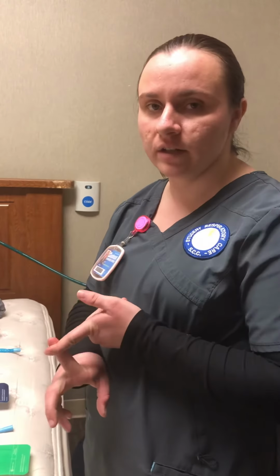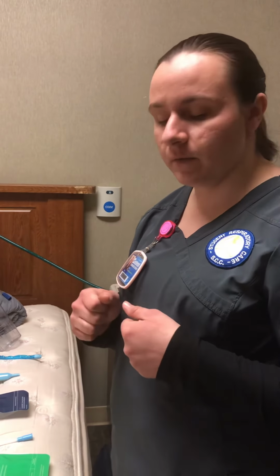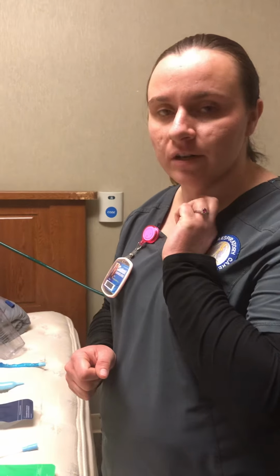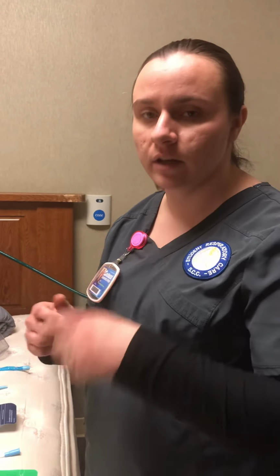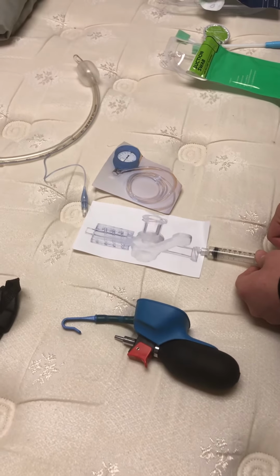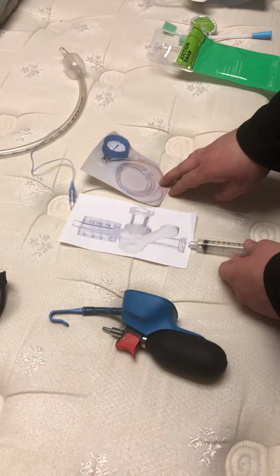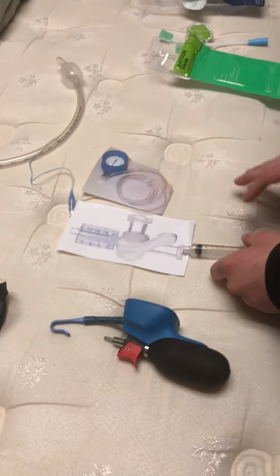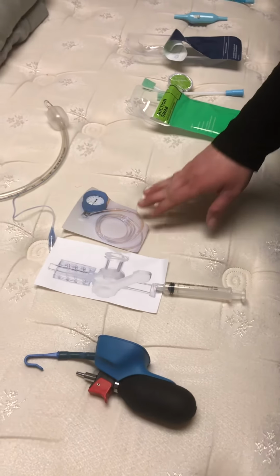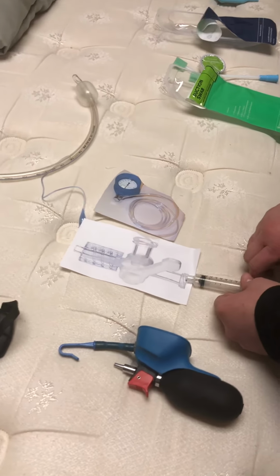So you're going to do your minimal leak test and your minimal occlusive test. What you're going to do for your minimal leak is listen to the side of the patient, so that way you can hear that first initial leak, that gurgling or crackly kind of sound. So when you're ready, you're going to slowly remove the air until you hear that leaking sound. And you can also take note always of your meter, so that way if there's anything wrong, you can always note there.